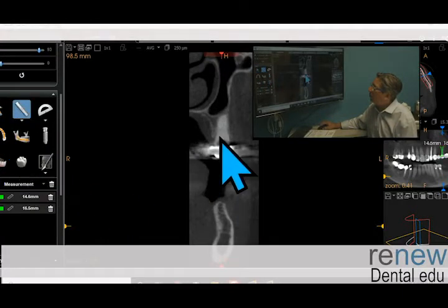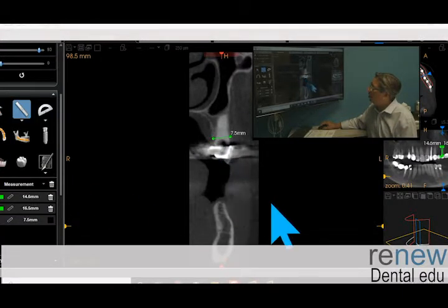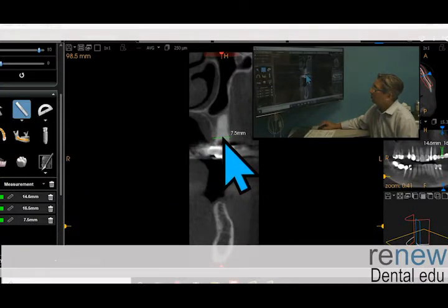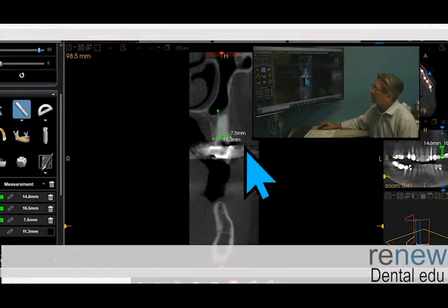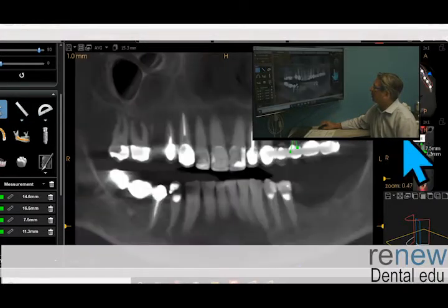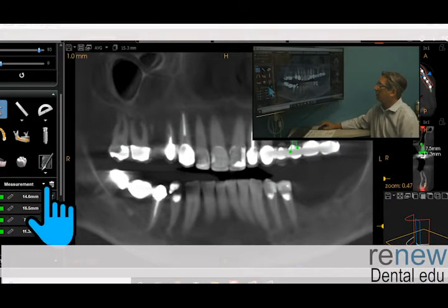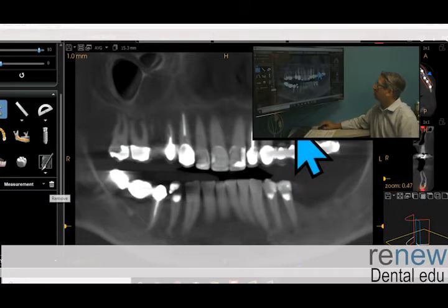I don't remember, but I do know that there was a failure up here, and I'm not sure if that doctor did a graft or not. I'd have to look at my notes to see, but this is not a site that you want to leave ungrafted. I like the ridge width. I think that's okay, and I think the height isn't too bad either. And so you could do something pretty straightforward here. But the funny part here is that you've got this shoulder where you just drop off completely. So let me get rid of some of these measurements here. I don't know if you could see this, but the sinus goes here and then just drops.